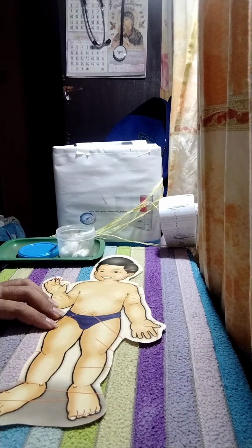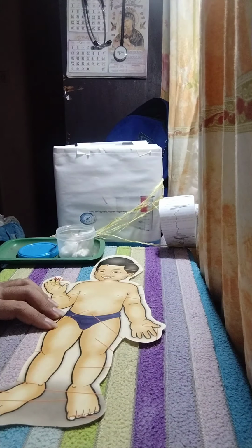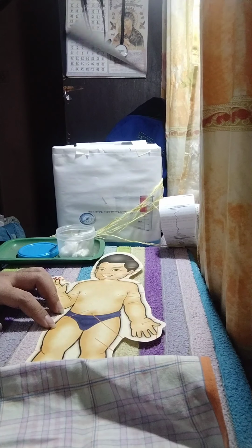After disconnecting the lead wires from the electrodes, dispose of all the electrodes and return the patient to a comfortable position. Lower the bed height and adjust the bed to a comfortable position. And then drape the patient.